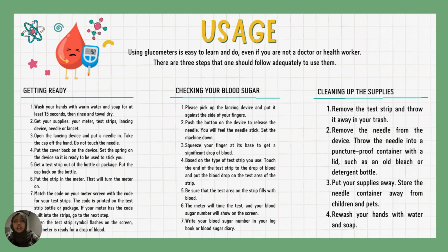The last step, clean up the supplies. Remove the test strip and throw it away in your trash. Remove the needle from the device and throw the needle into a puncture-proof container with a lid, such as an old bleach or detergent bottle. Put your supplies away. Store the needle container away from children and pets. Rewash your hands with water and soap. Thank you.